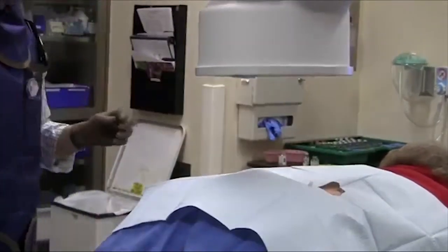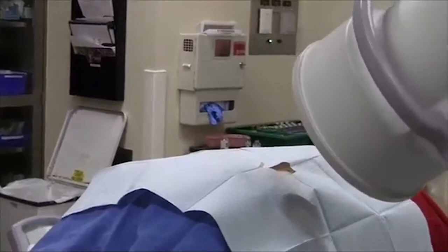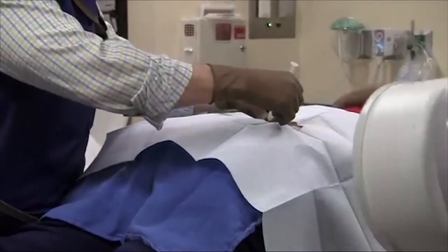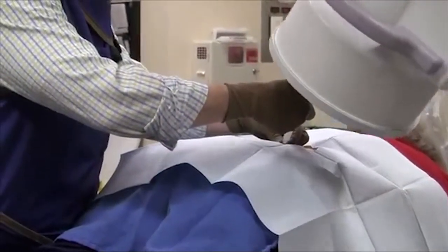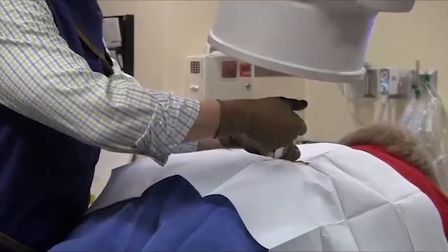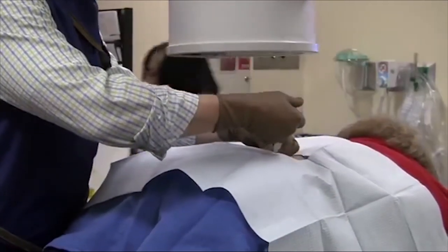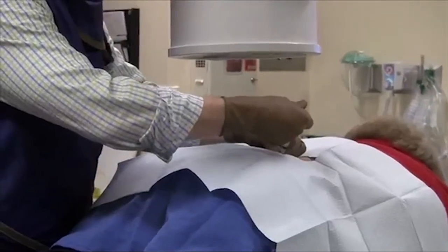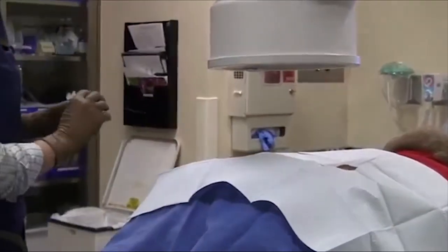Once that location has been confirmed, multiple images are obtained to ensure that we are in the exact location. The patient is then injected with the medication, most typically a steroid and a local anesthetic.